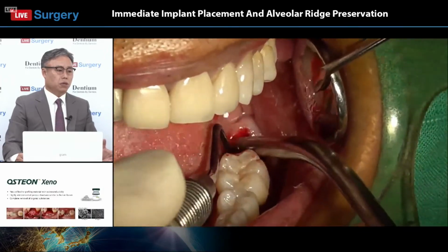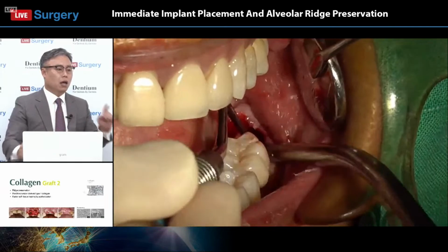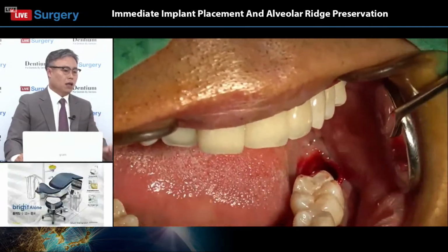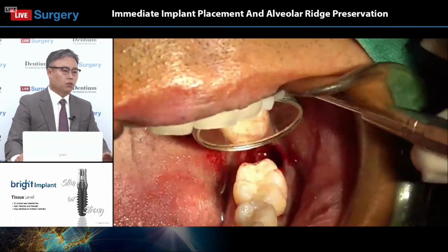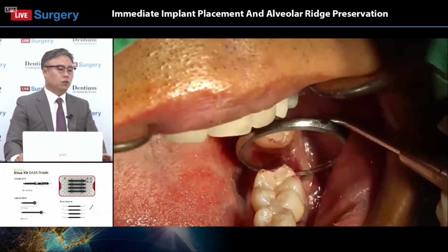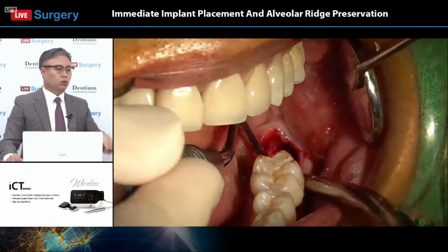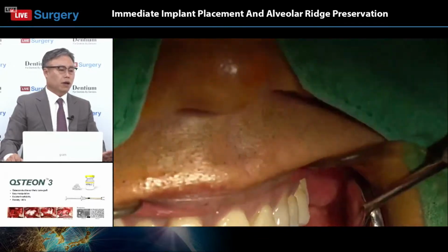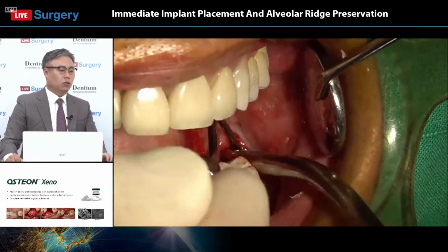As I mentioned, a curved surgical curette is good for applying to the buccal and lingual side. And another thing, when you are removing the granulation tissue on the lingual side, there is one important anatomic structure there, the lingual nerve. Just be careful not to go too much into the distal area. The lingual nerve goes through the distal area, second molar region. Therefore, on the lingual side, you have to be very careful not to damage the lingual nerve.